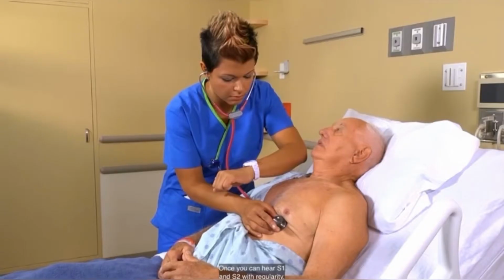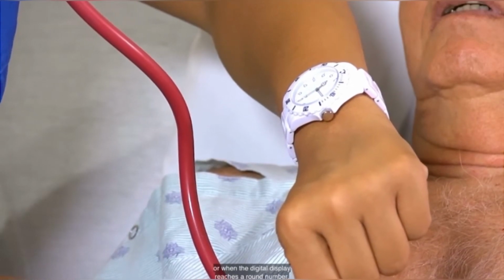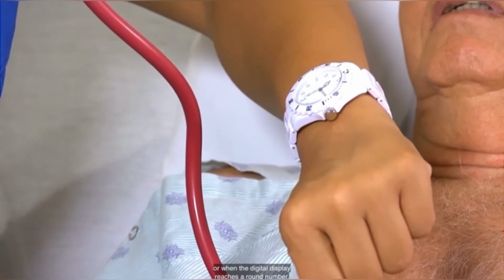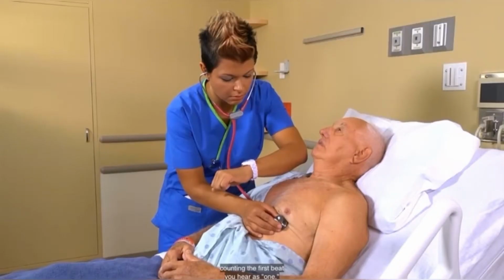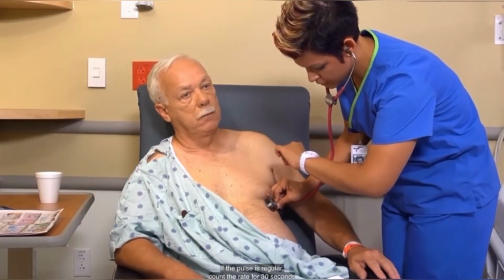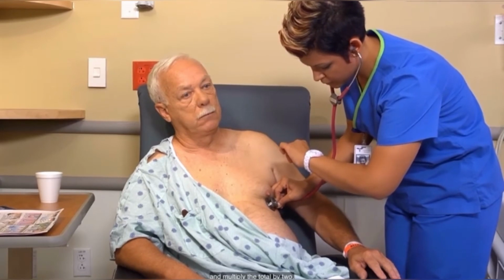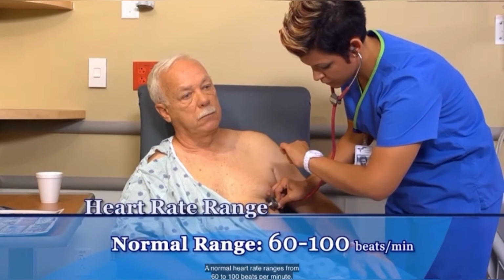Once you can hear S1 and S2 with regularity, look at your watch. When the second hand reaches a number on the dial, or when the digital display reaches a round number, begin taking the apical pulse, counting the first beat you hear as 1. If the pulse is regular, count the rate for 30 seconds and multiply the total by 2. A normal heart rate ranges from 60 to 100 beats per minute.